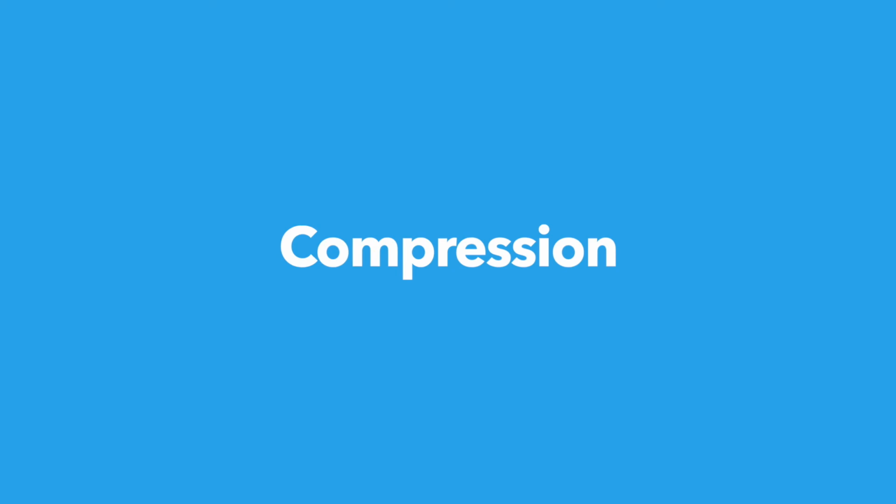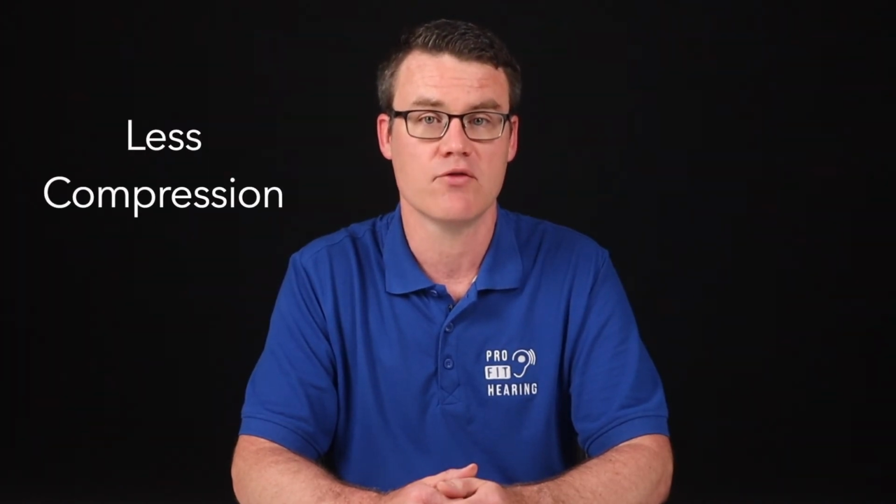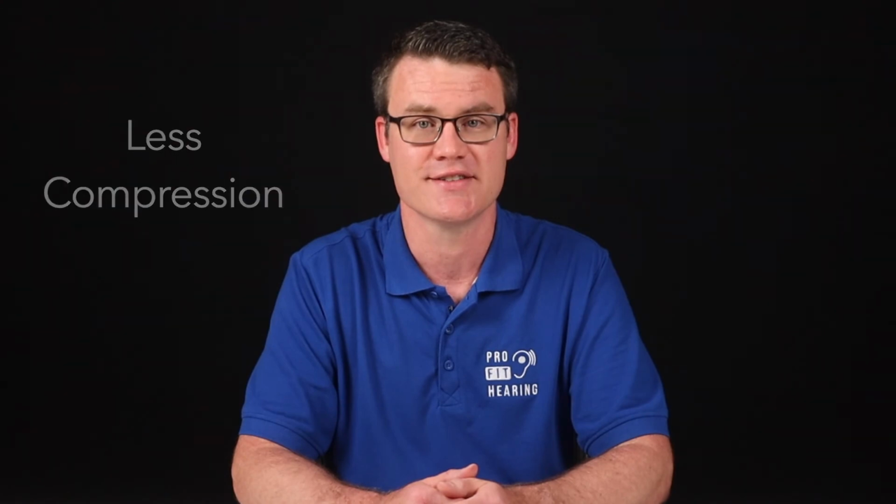Number 4, compression. Compression is used to turn down louder sounds that exceed a certain volume level. This reduces a sound's dynamic range, and it's used to provide a hearing impaired person with more sounds that are audible. Less compression is recommended for more natural sounding music.